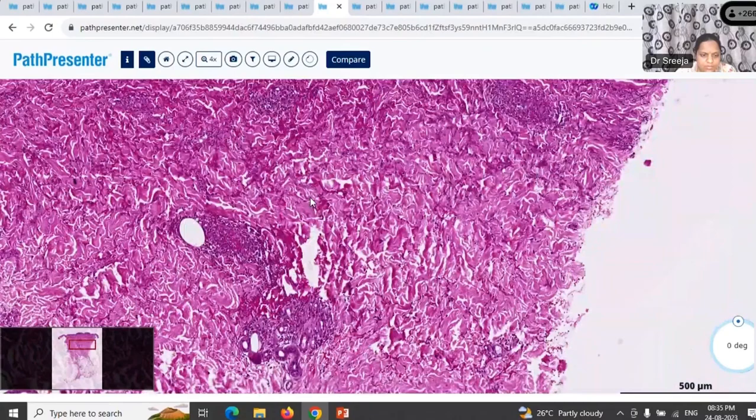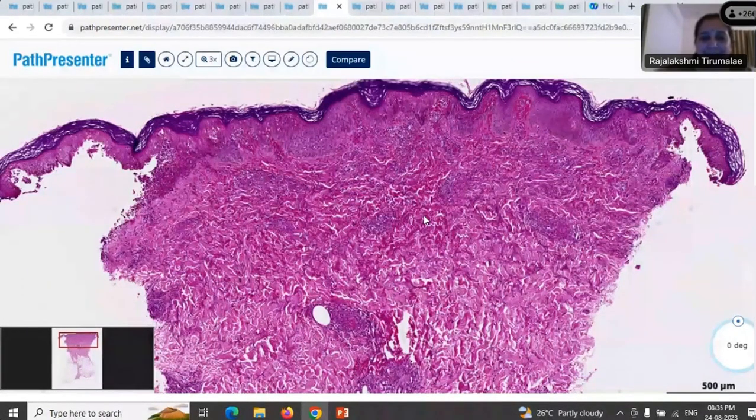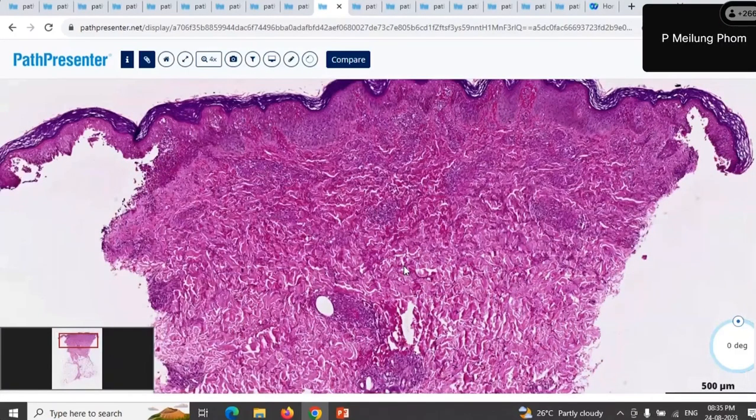Do you want to comment anything on the color of the biopsy? So far, you've seen all the other biopsies. It's not because the section is thick. Does it look very pink or very red to you? Yes, ma'am, it does. Yeah, that's right. Now go to the infiltrate.